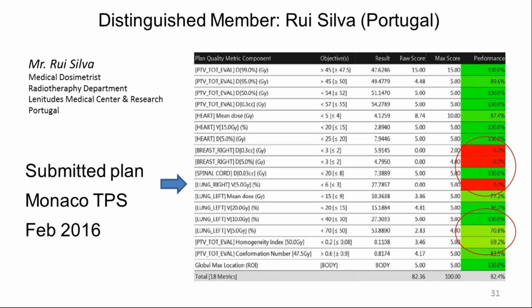Now, this is something I would really like to share with you. One of our top planners in Monaco is Rui Silva from Portugal. He's a medical dosimetrist. When he submitted his plan in February 2016, he scored 82.4, and he was one of the main panelists in our previous Monaco live webinar.